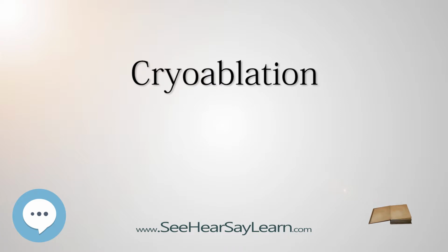Fibroadenoma. Cryoablation is also currently being used to treat fibroadenomas of the breast. Fibroadenomas are benign breast tumors that are found in approximately 10% of women, primarily ages 15-30. In this procedure, which has been approved by the U.S. Food and Drug Administration, FDA, an ultrasound-guided probe is inserted into the fibroadenoma and extremely cold temperatures are then used to destroy the abnormal cells. Over time the cells are reabsorbed into the body.